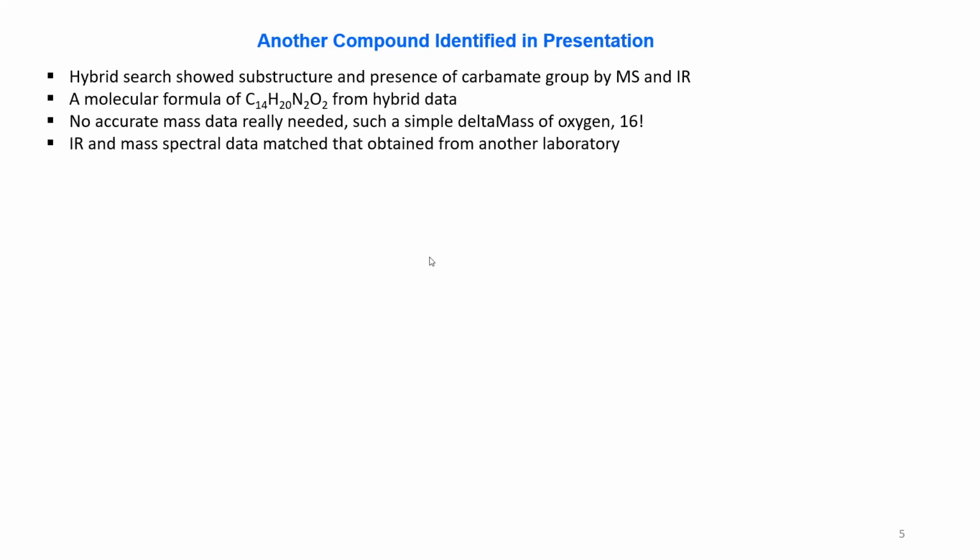The IR and mass spectral data matched that obtained from another laboratory and our proposed structure in the presentation. You can see it below. It had a molecular weight of 248. It is an ethyl carbamate.